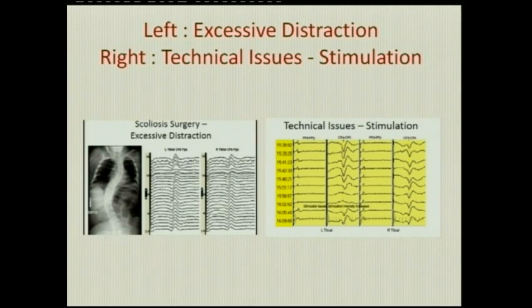They also disappear, telling you that there is a stimulation failure. When you adjust the strength of stimulation, they come back. So you have to check yourself before going to the surgeon and asking him to stop.